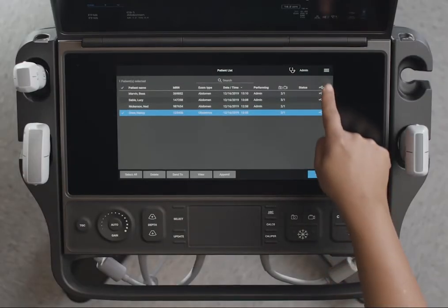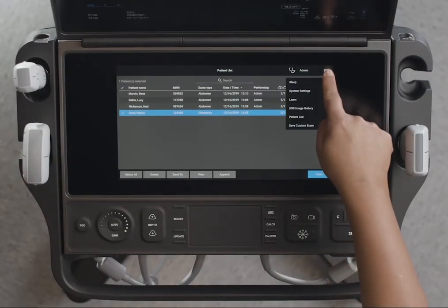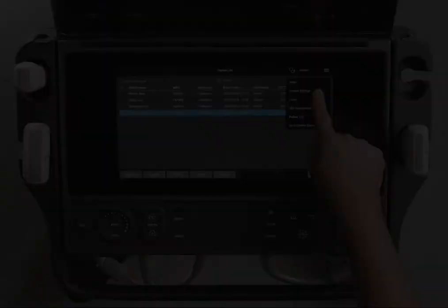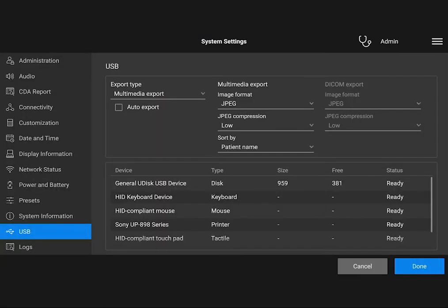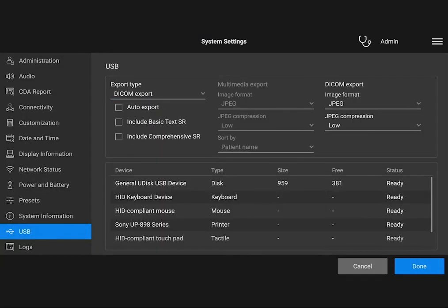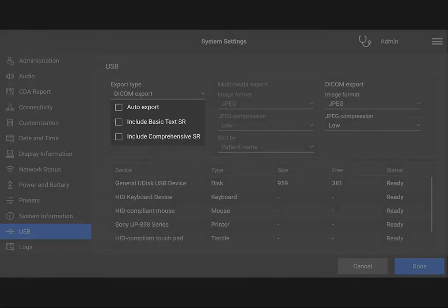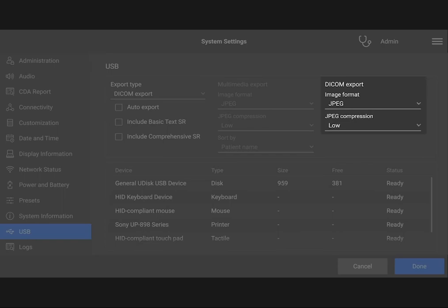Now let's talk about exporting data to DICOM. First, set your export option to DICOM. You can choose to export automatically to DICOM and also include certain types of structured reports, as well as choosing your image formats.